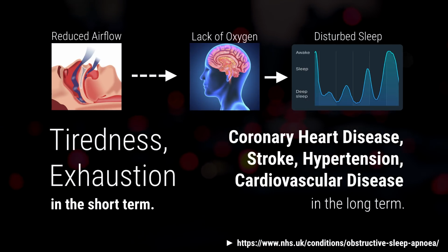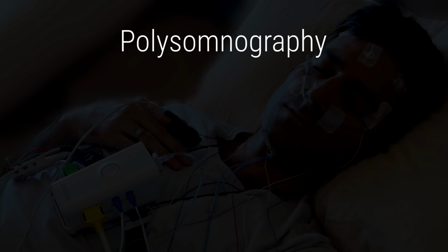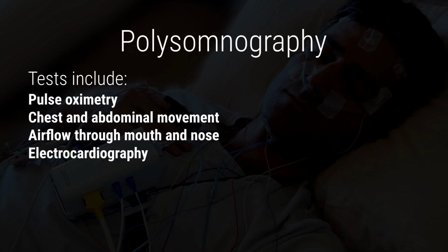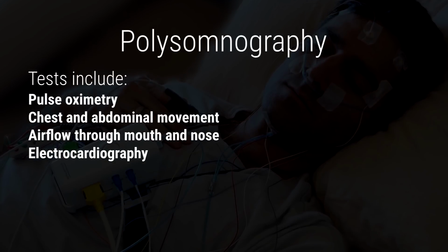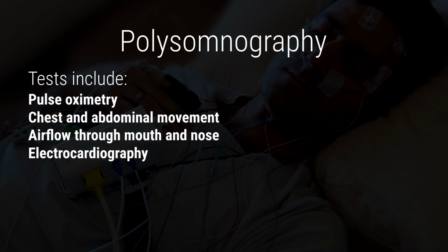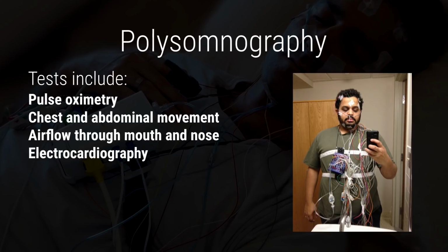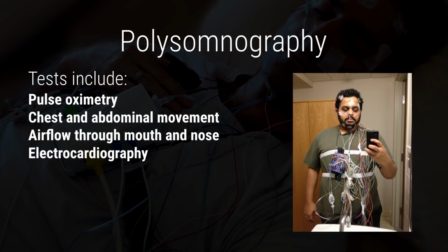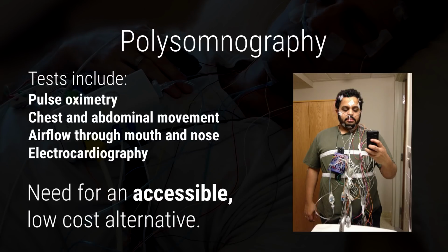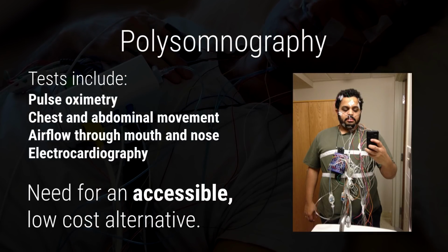Currently, the gold standard for diagnosing sleep apnea and other sleep disorders is polysomnography, which involves a wide variety of different tests. For the millions of people who aren't even sure they have OSA, polysomnography isn't a particularly accessible or comfortable method of checking. Some sleep clinics do provide equipment which you can take home to record yourself with, but this generally isn't cheap. There's need for a widely accessible, low-cost method of self-recording and classification.